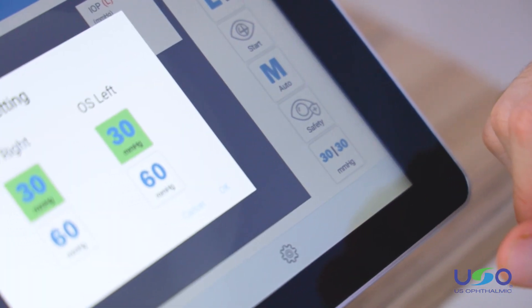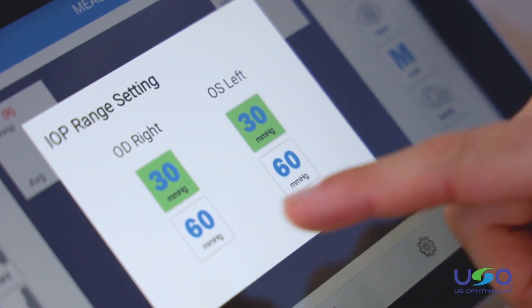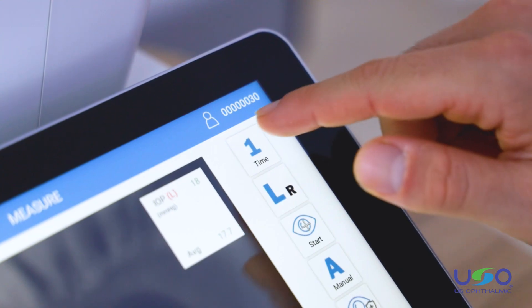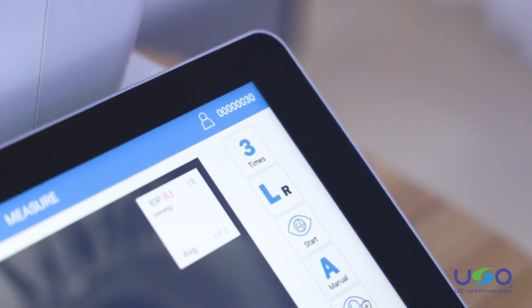In order to ease the experience for patients, the ETN 1800 allows the doctor to choose between 30 and 60 millimeters of mercury of air pressure and decide how many measurements — between one and three — that the ETN 1800 will take.